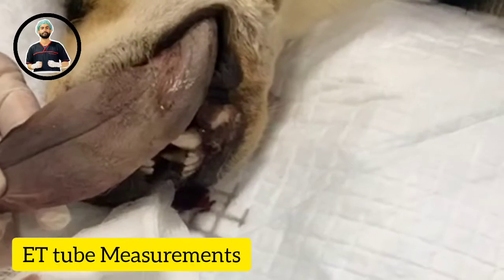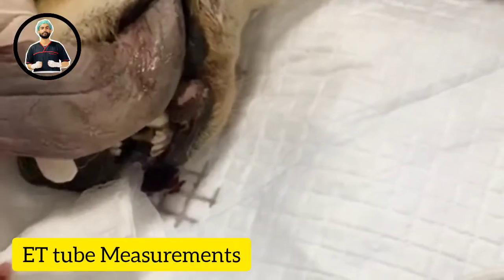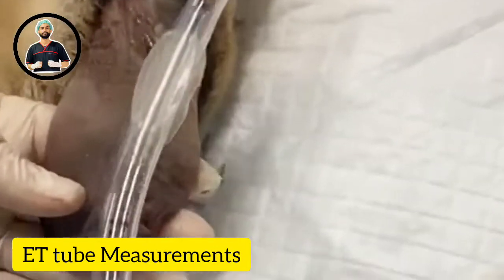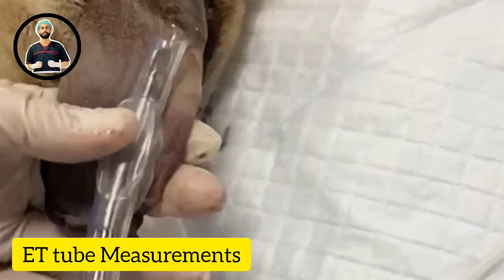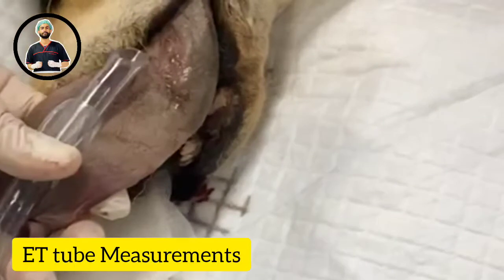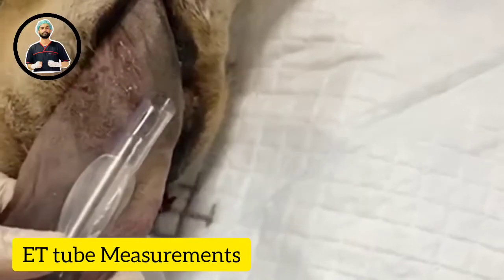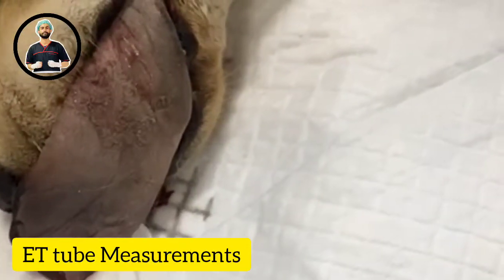That rule doesn't apply to bulldogs or any snub-nosed dog. As a rule of thumb, this tube is going to be too small. This dog could easily take a 10.5 or an 11. It needs to be as snug as possible down the trachea. So roughly, as a rule of thumb, if you're in an emergency, as long as you've got roughly half the width of the tongue, you're good to go.